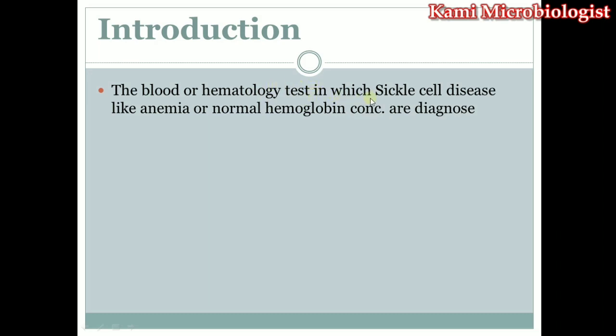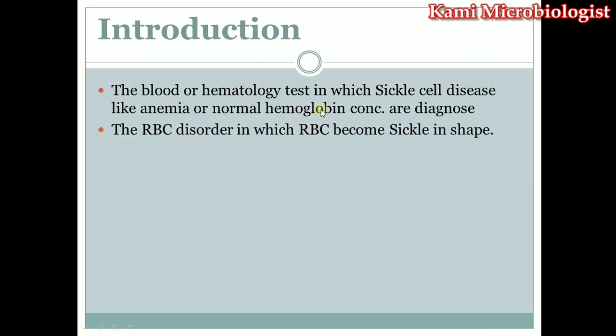And we have the sickle cell test. So the sickle cell test is a test in which we mostly check for sickle cell disease like sickle cell anemia, or we mostly see the normal hemoglobin concentration in the blood. Then we have the sickle cell disease.